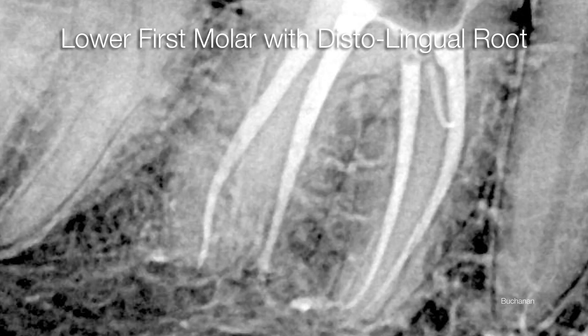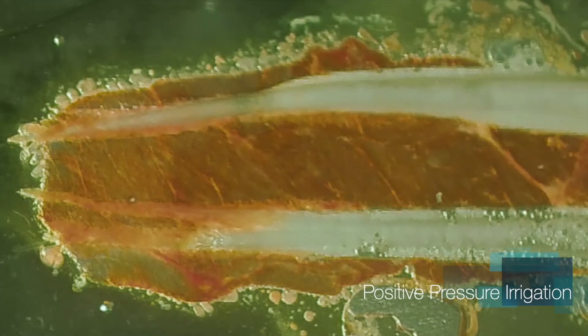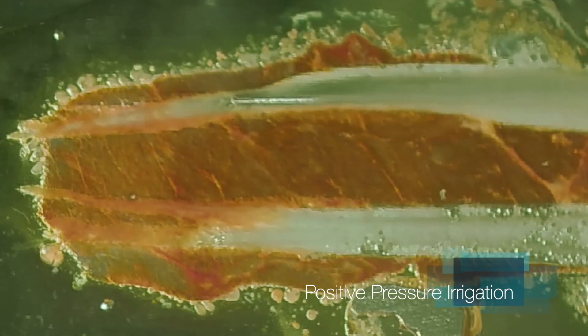All three of these small molar canals were instrumented with just the single 1306 traverse rotary negotiating file by Kerr Endodontics. Now back to the previous block.